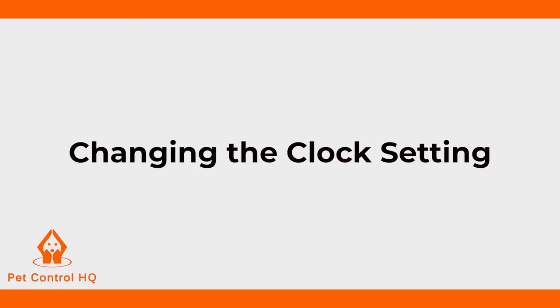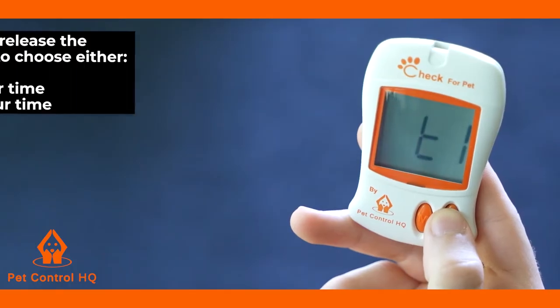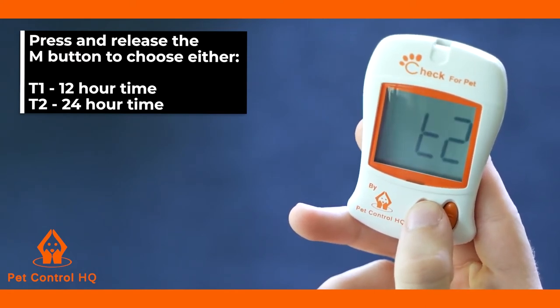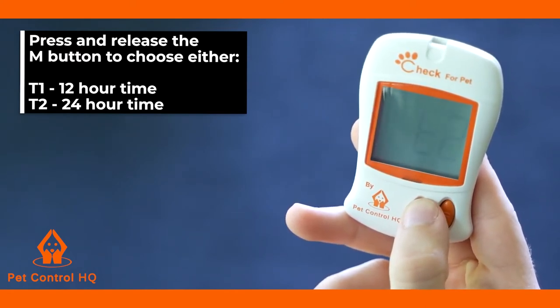The clock setting will then be displayed on your monitor screen. To change the clock setting, press and release the M button to choose either T1, 12-hour time in a.m. or p.m., or T2, 24-hour time.